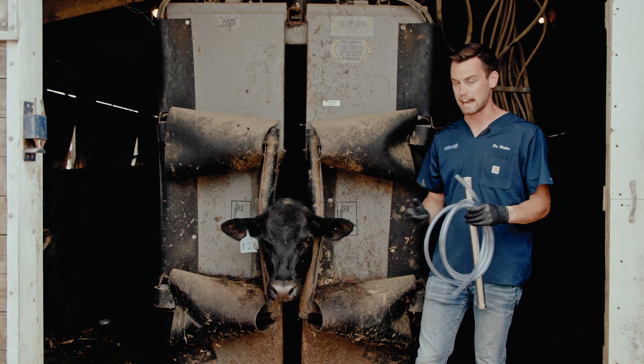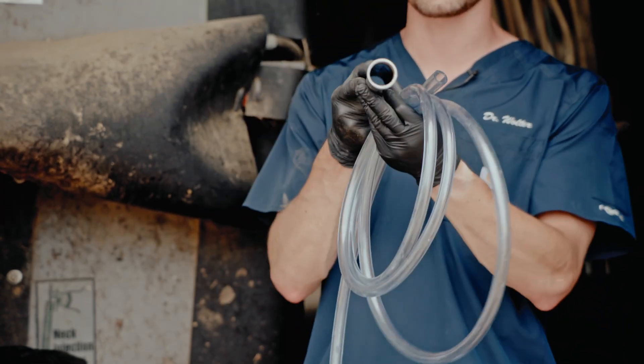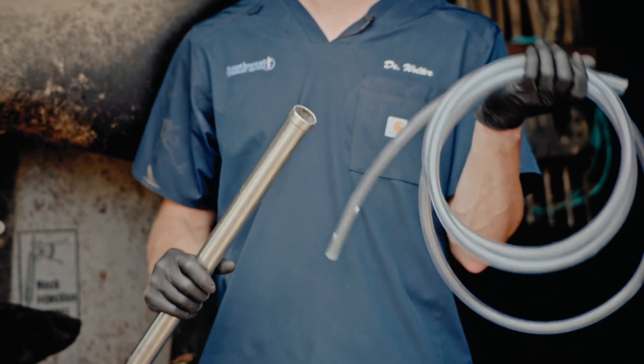When we tube a calf there are two main things you're going to need. First, you're going to need a metal speculum — essentially a metal hollow tube that protects the hosing when we pass it through the mouth and makes sure they can't chew on it.